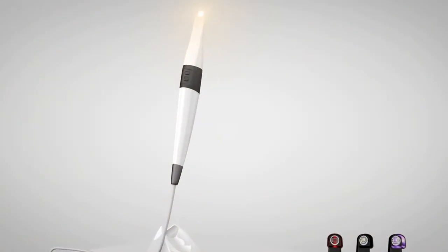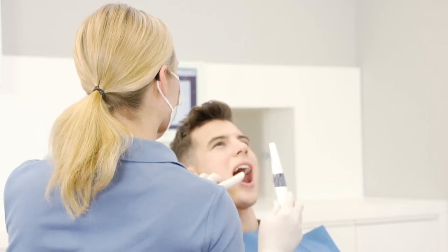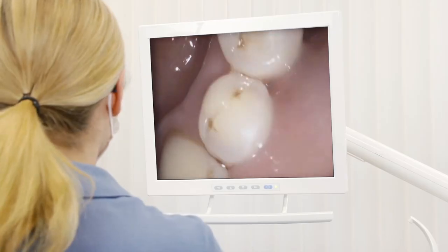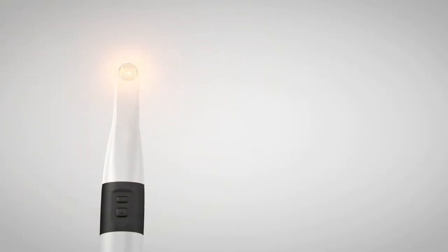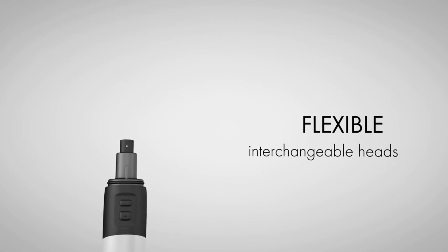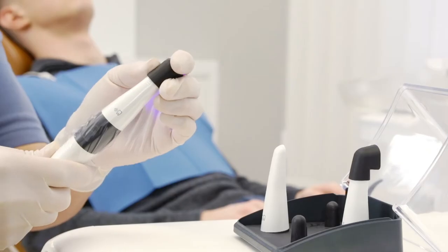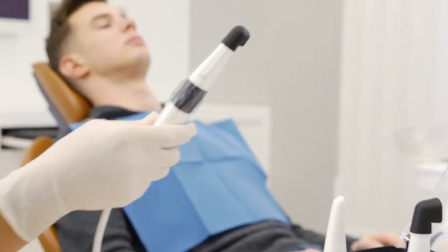The Vistacam iX-HD smart intraoral camera provides a reliable diagnostic tool that can be used both before and after treatment. The interchangeable head technology is highly flexible and provides reliable support during the process of diagnosing caries.